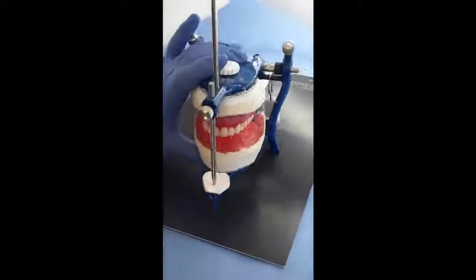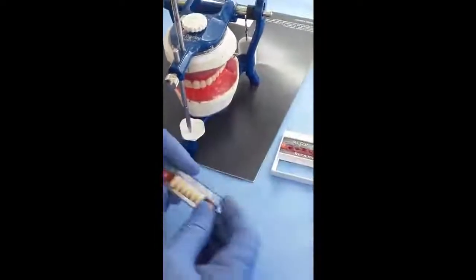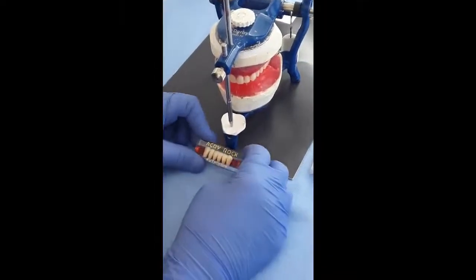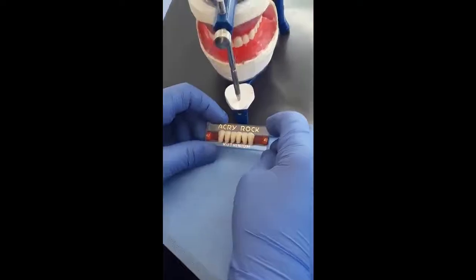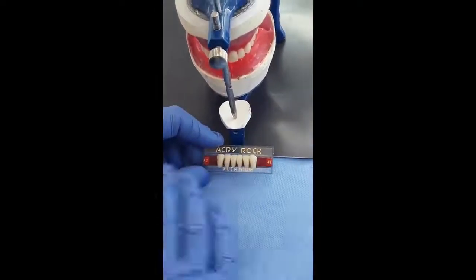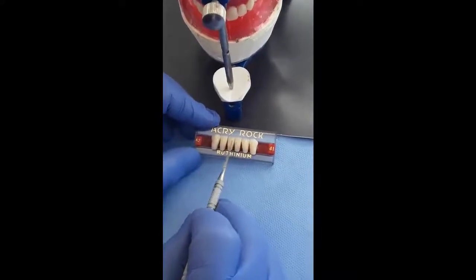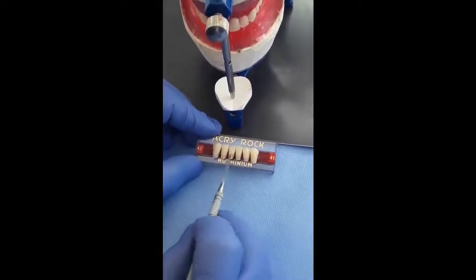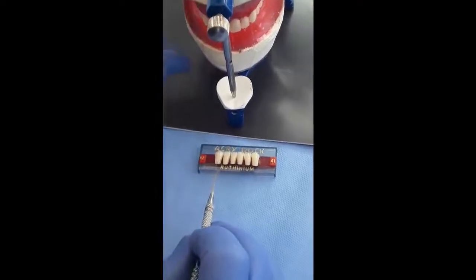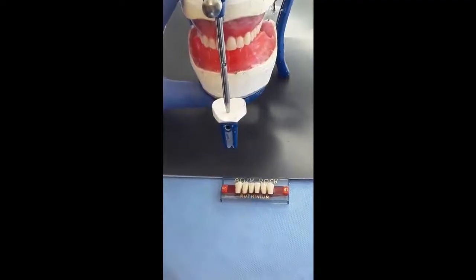and we are going to proceed now for setting of the lower anterior teeth and make sure that we put the display piece in this situation so we will not be confused between right and left. This is the left side, this is the right side, and we'll start setting the lower central incisors.